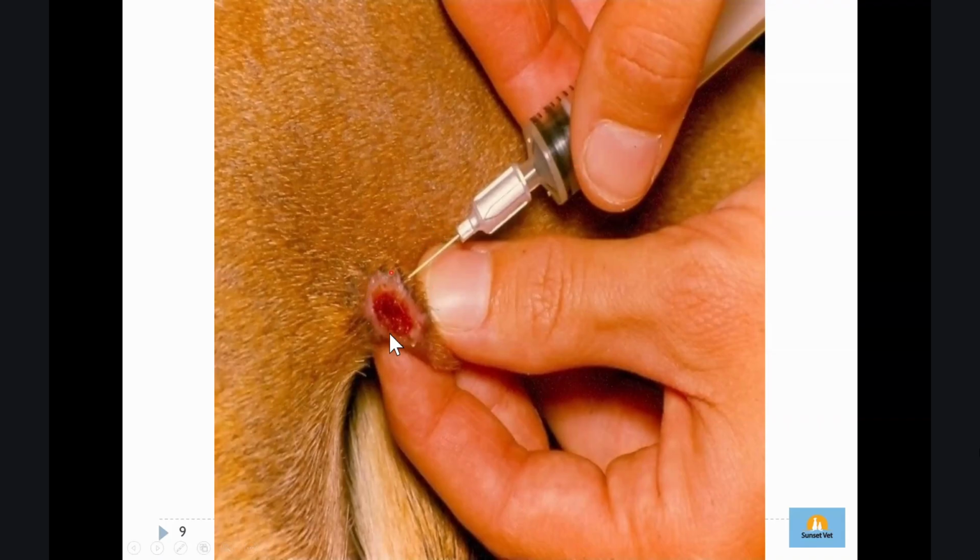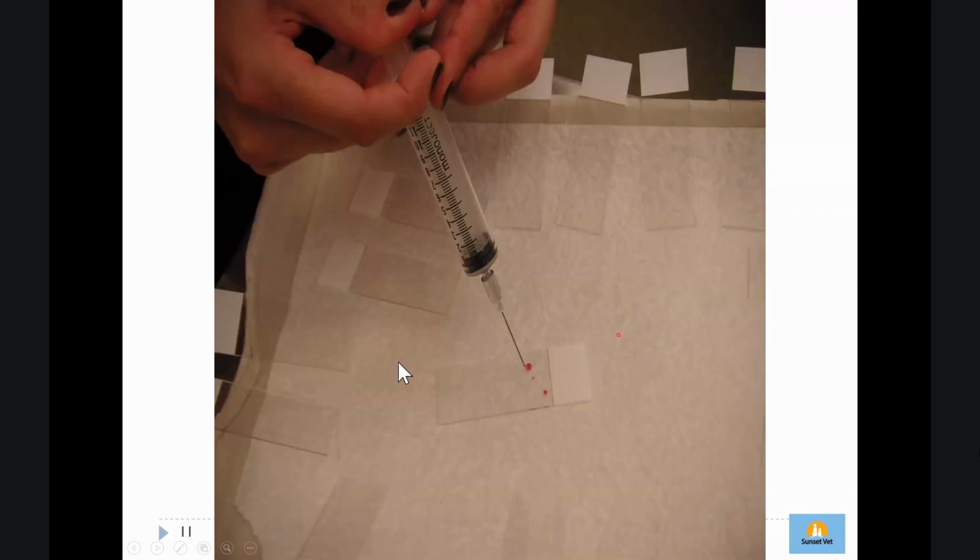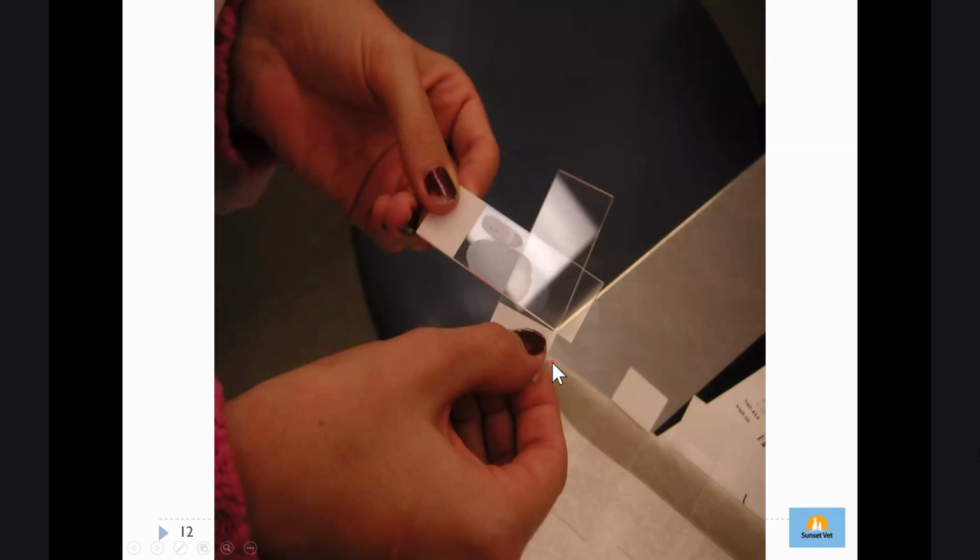So this is the mass. If it's only raised a little bit, you stick the needle in, it's the same. You go in all directions because we want to get a good and enough sample. And then after that, you take out the syringe, fill it with air, and spray it onto your object glass. After that, you can just do an impression like this.